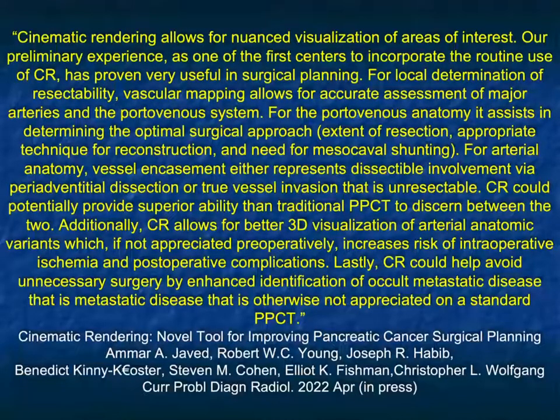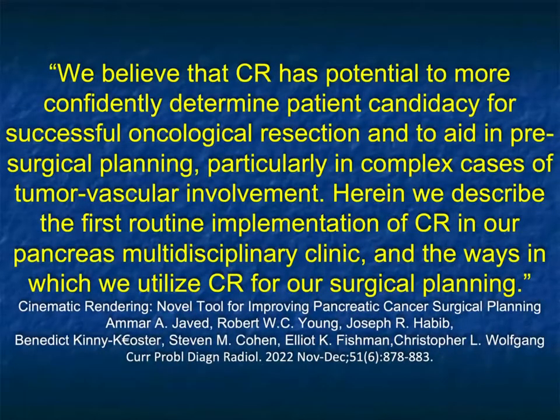I think there's a very good article for you to read. Look at the last statement. CR could help avoid unnecessary surgery by enhanced identification of occult metastatic disease that is otherwise not appreciated on a standard pancreatic protocol CT. So lots of potential advantages. And again, this is something you need to implement into practice. And this article does explain a lot of the things we do and how we use it in our multidisciplinary pancreatic conference.